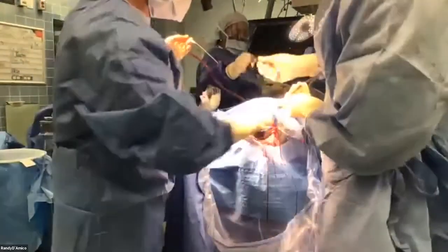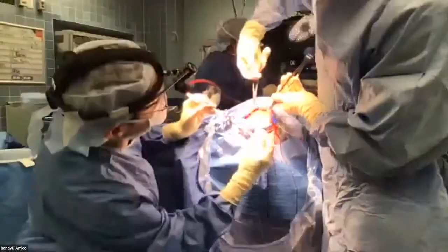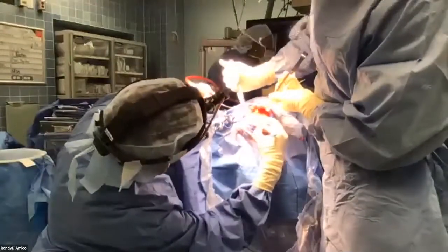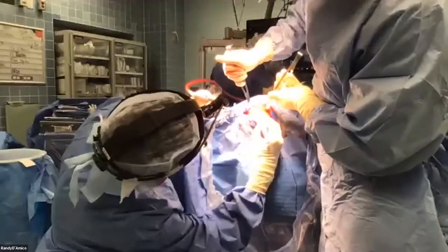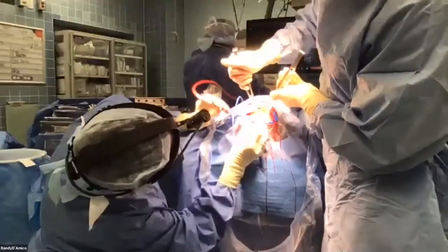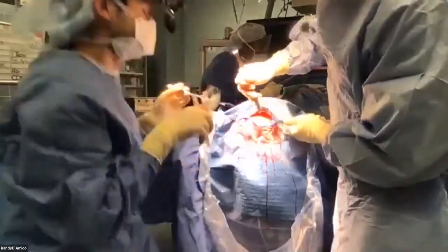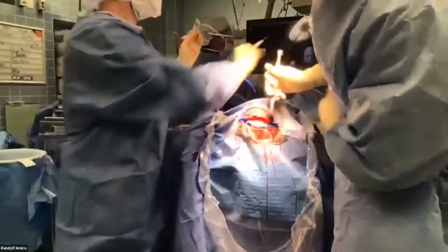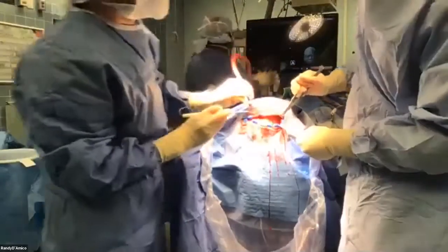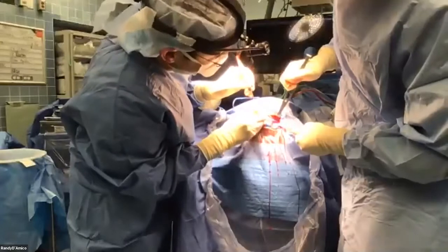So basically what we're going to do is elevate the scalp here that's now separate off the bone. He's going to go as far forward as he can without cutting through the skin. You can start wherever you want. You can start with bigger, go deep. And he's going to take a big, basically, sheet of this stuff off the skull. And it's going to shrink down. At the end, we're going to be able to stretch it out and use this to cover it. So go take it as far as you can.